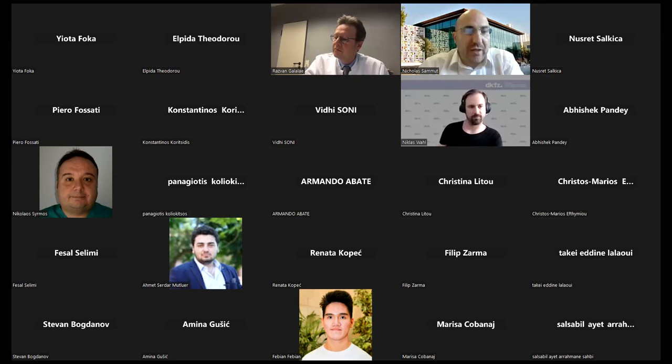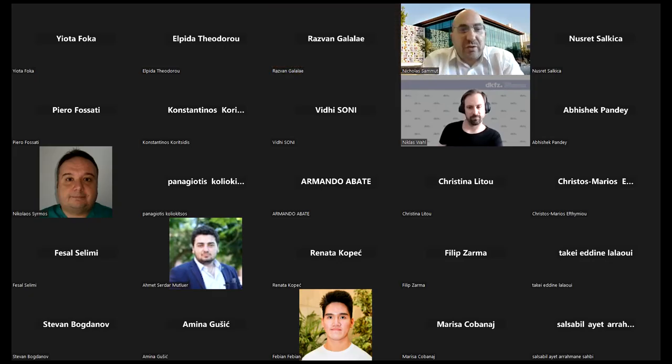Our final session for today. I invite Niklas Wahl from DKFZ with Jota to demonstrate the installation of MatRad as a preparation for tomorrow's afternoon treatment planning session. And tomorrow's session in the afternoon, session 7, after the lunch break, is a special session, a different kind of session. It will be very much hands-on.